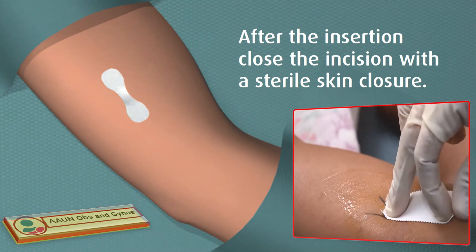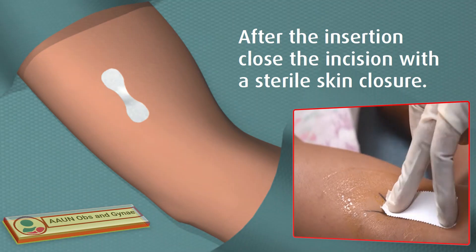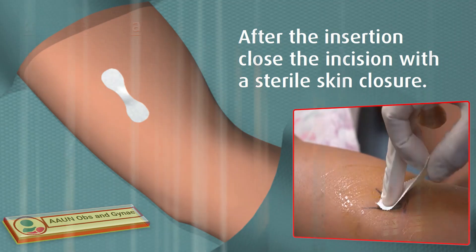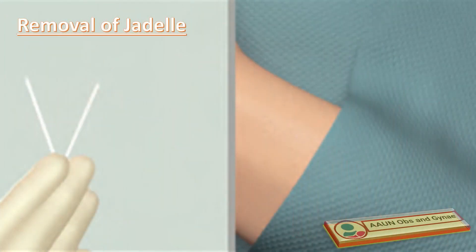After insertion, cover the insertion area with a compress and wrap enough gauze around the arm to ensure hemostasis. A sterile dressing is applied at the end.